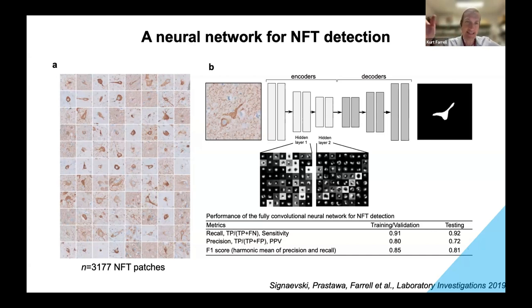And so we had stained all the hippocampuses on the same auto stainer that again was brought up earlier, the Leica systems. This can do 30 slides. It's not done by hand, using AT8 at the same concentration. And we were able to generate this very large data set, which we also had some metric of cognitive impairment.